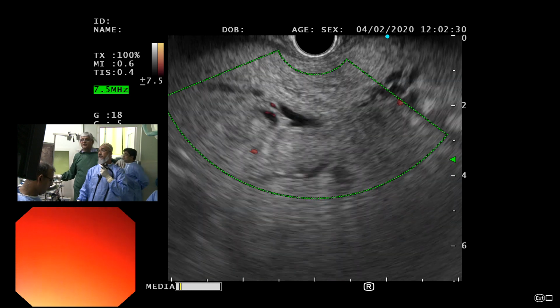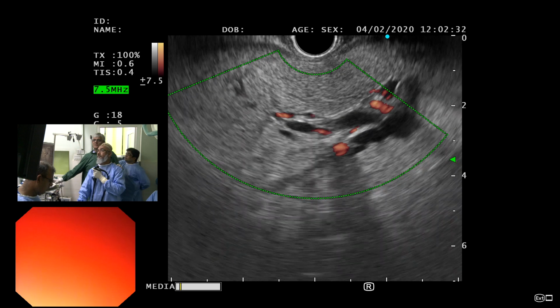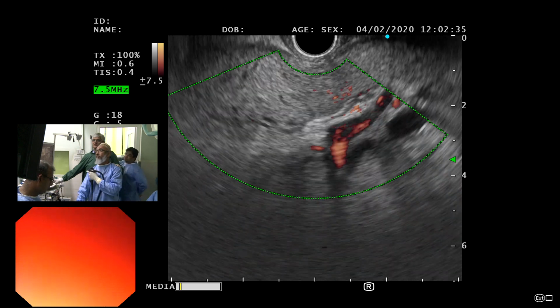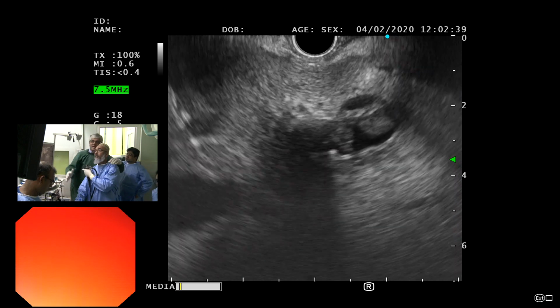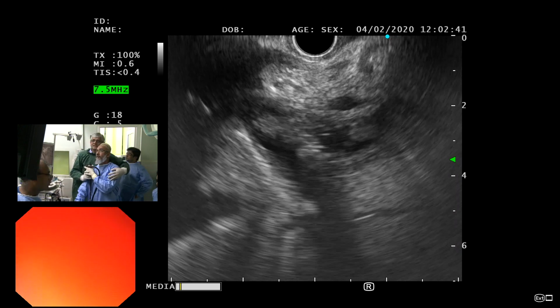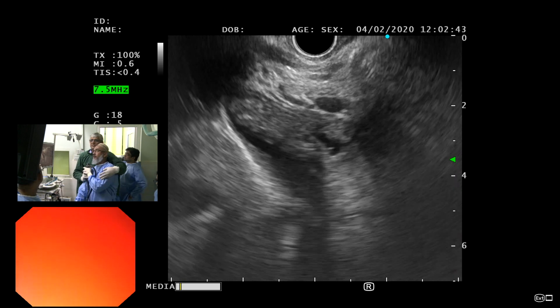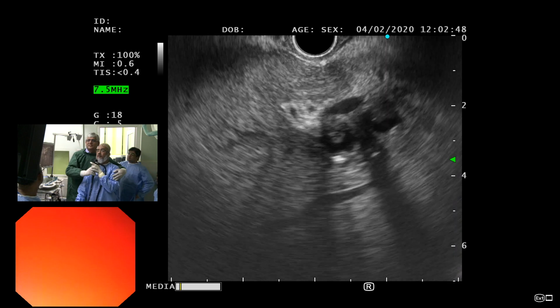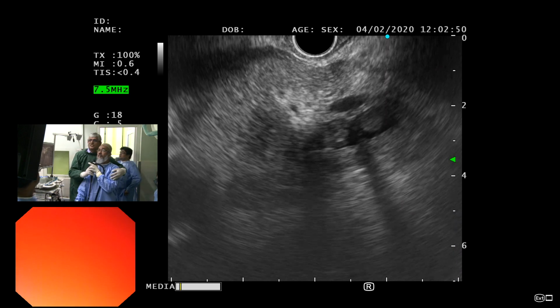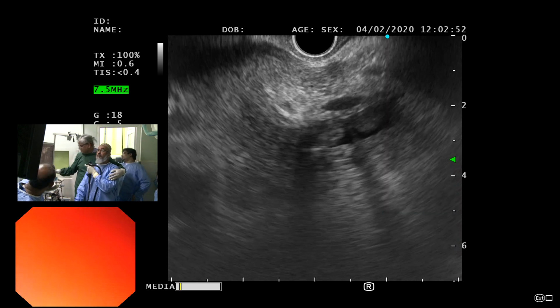और थोड़ा सा rotate करो. लिवर को देखते जाए. पूरा लिवर को आप एक रोटेशन में स्कैन कर सकते हैं. Yeah, here basically there are small target lesions. I saw one of them. Yeah, so there are multiple. And now I don't know whether you can see this. Wait a minute, let me see. There, can you see this?